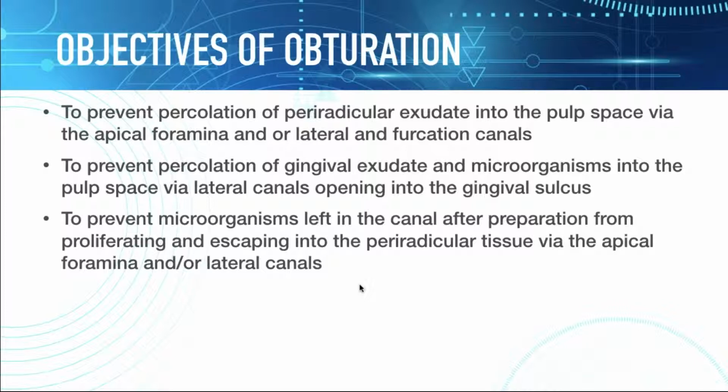Now, we're never able to really remove all bacteria from within the dentinal tubules. Even the best irrigation systems, ultrasonics, sonics, even apical negative pressure, are able to get our irrigants maybe 100 micrometers, maybe a little bit more, into the dentinal tubules. And we know that bacteria can be in those dentinal tubules up to 400 micrometers. A laser light has the ability to get into those dentinal tubules 1,000 microns, but by and large, the general irrigation delivery systems are only able to get about 100 microns. So there may be some bacteria left within the dentinal tubules.